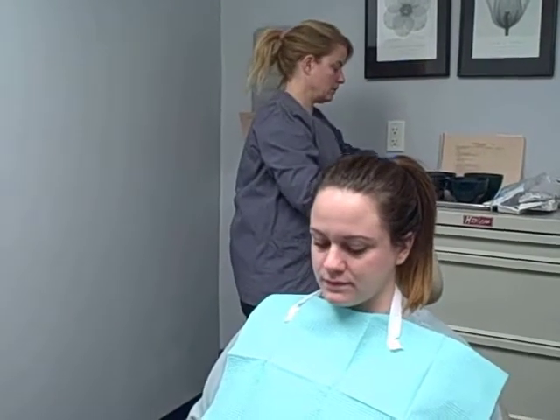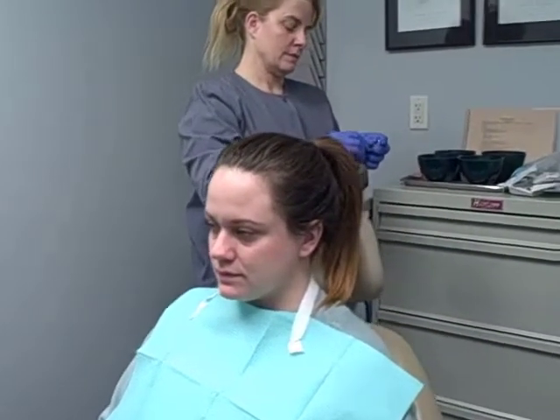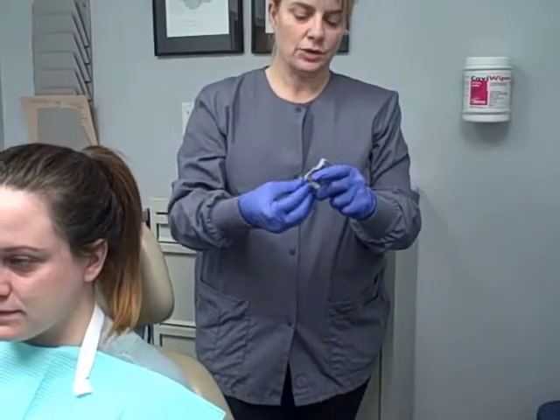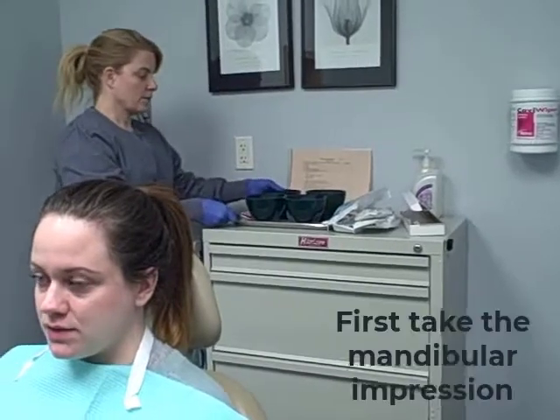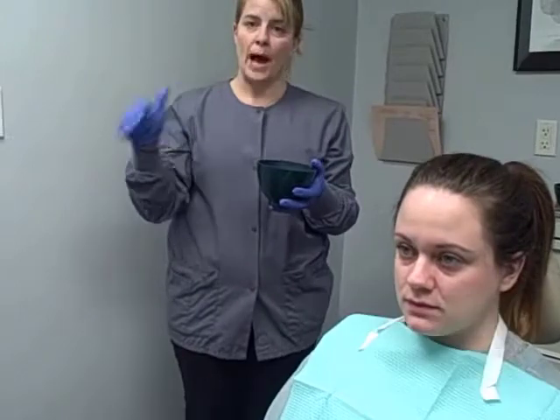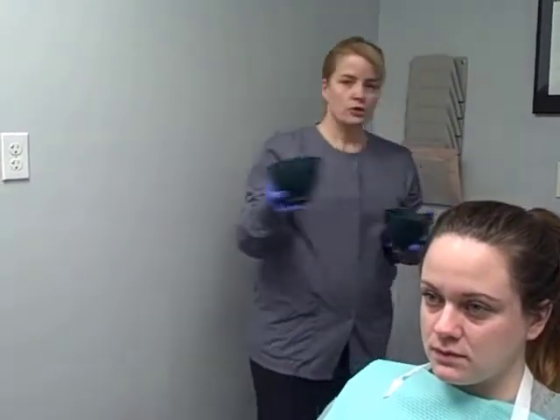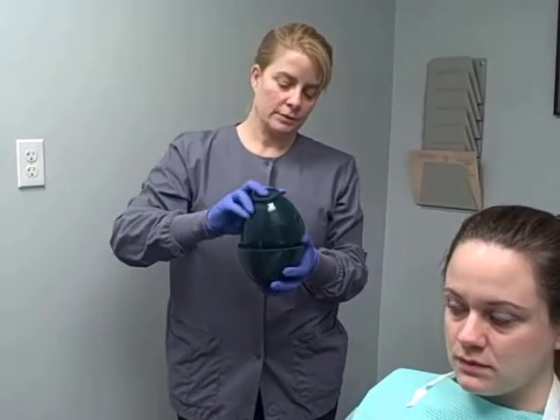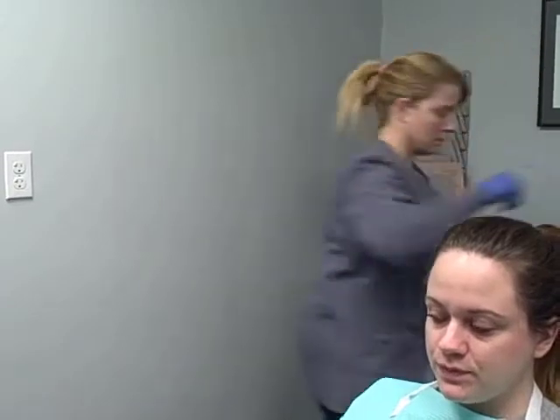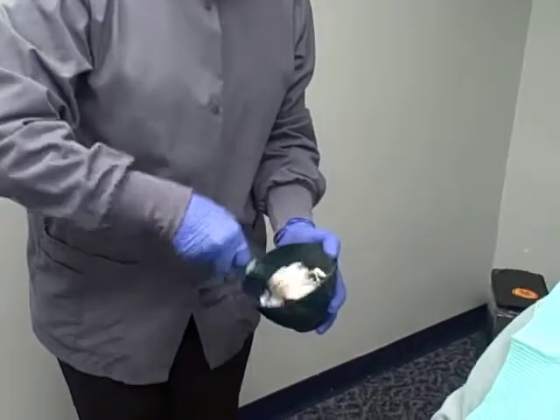Put that on the mandibular, which we're going to do first, and then on the maxillary — add it to that back, posterior edge of that tray. We're going to do the mandibular first. We have our water. We're going to pour the powder into the water — that's very important. Two scoops for the mandibular. Powder into water. Then we're going to mix it up, get it all wet.